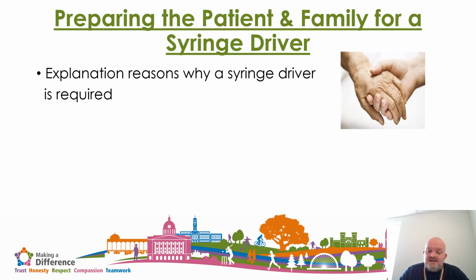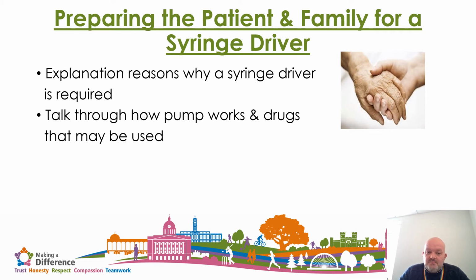So it may be about discussing their condition and the fact that they're not able to swallow their medication, or it may be discussing the fact that the oral medication they're taking, because of their nausea and vomiting or their bowel obstruction, isn't working properly. So a syringe driver is a better way of giving that medication.